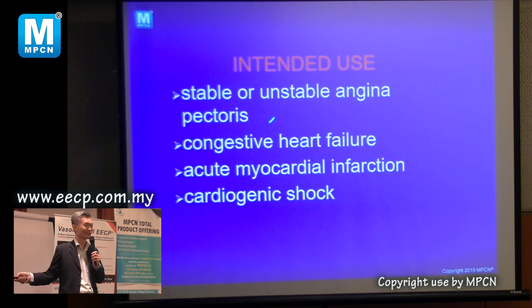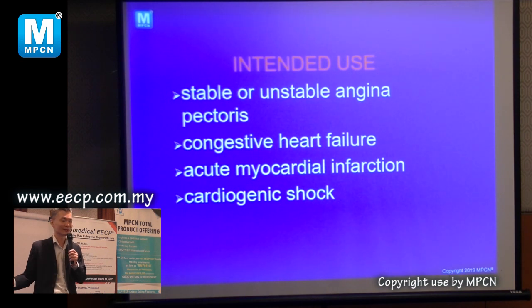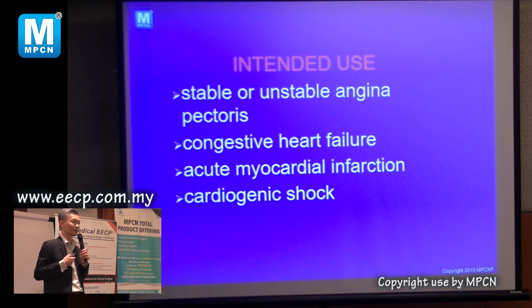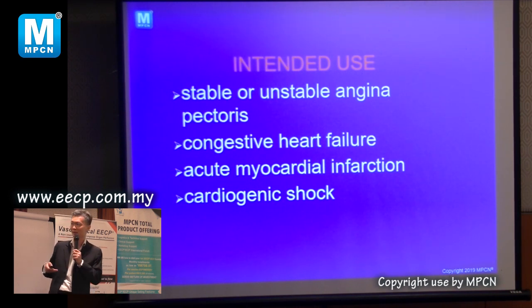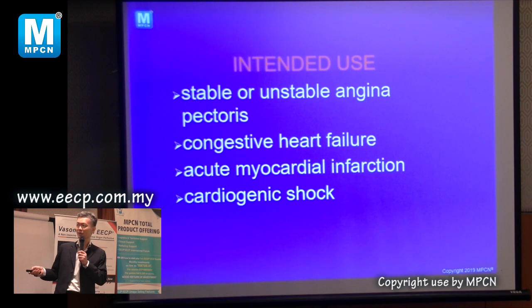So this is a proper use. Patient with angina, stable or even unstable, you can also use. It's safe as long as they are not in heart failure, with water in the lungs, and those contraindications are not there. Heart failure can be used as long as they are dry. So even though the heart is very weak, if they are dry, it can be done.